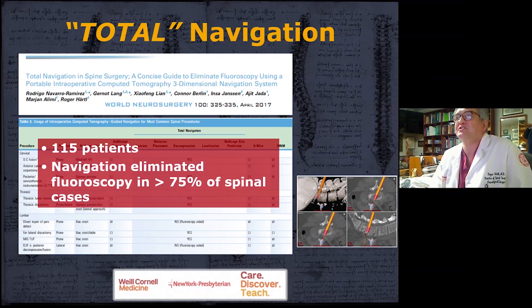We published a paper a few years ago. We found over our almost 15-year experience now, once you get really good at navigation, the nice thing is you can eliminate fluoroscopy, which really improves your workflow, especially for percutaneous pedicle screws. Navigation becomes very, very straightforward once you make it work, and once you can make it work with your surgical team and you've got some of the basic technologies available.